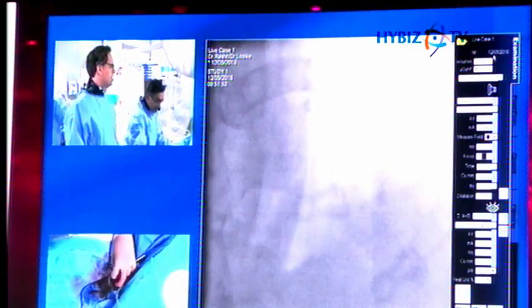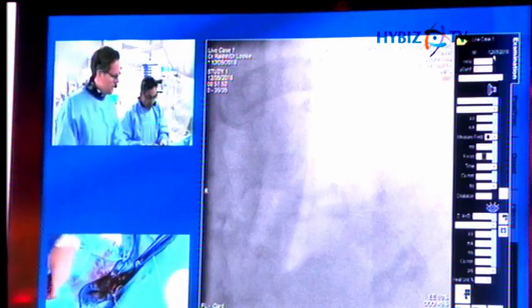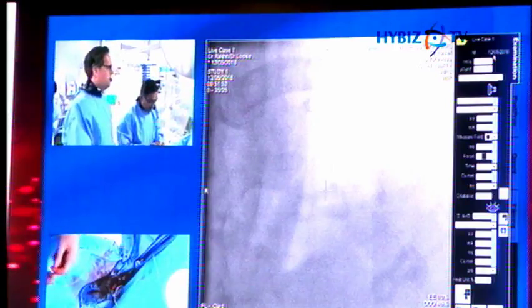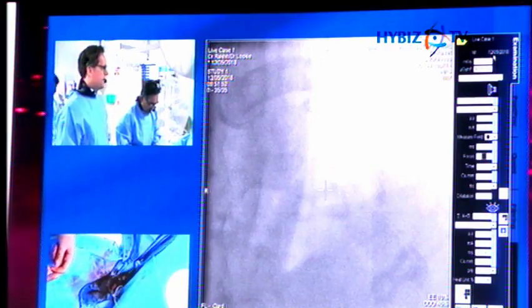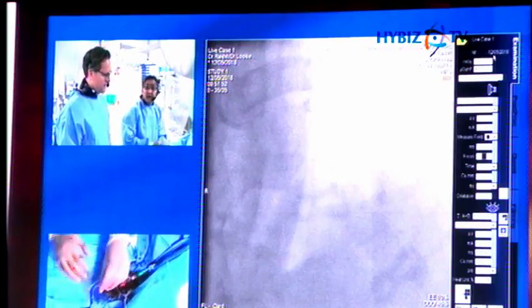You've had a lot of experience with it? I mean, it's certainly not a first line stent, and I don't think anyone advocates it as a first line. But certainly in ectatic vessels, we have quite a lot of patients with sort of vasculitic disease, Kawasaki's, that sort of thing. Yeah, and STEMIs with our vein grafts.